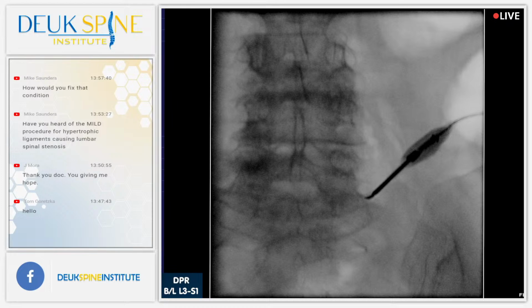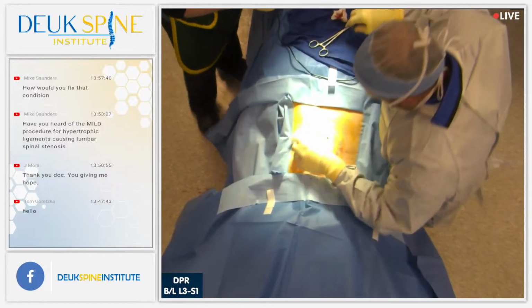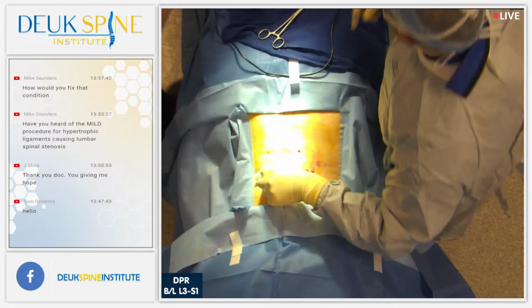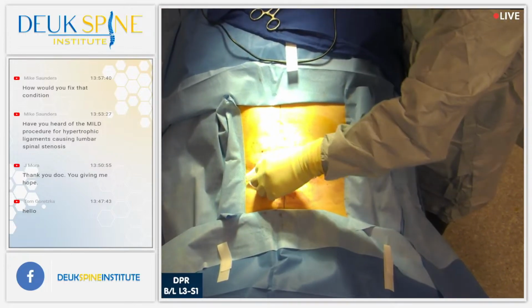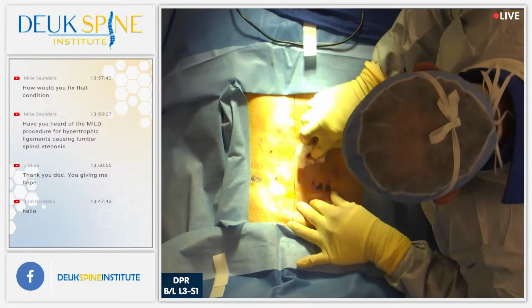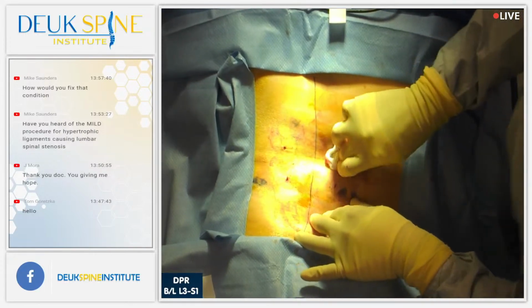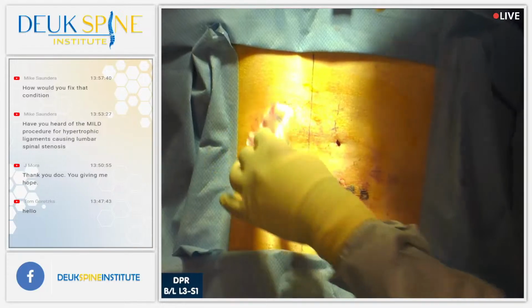Okay? So yeah, you can go strip out hypertrophic ligaments in your spine, but honestly, I've been doing these surgeries for 16 years, laser surgery. I don't touch the ligaments, okay? I don't touch them. They're still there, the hypertrophic ligaments, on every single patient I operate on. So why do my patients' back pain go away? Why does their leg pain go away? Because the real problem is the disc, not the hypertrophic ligament.